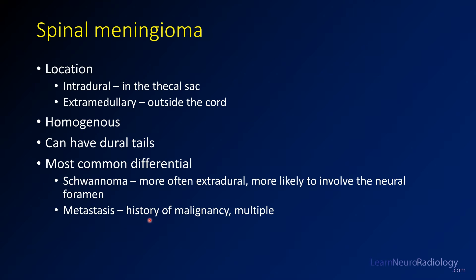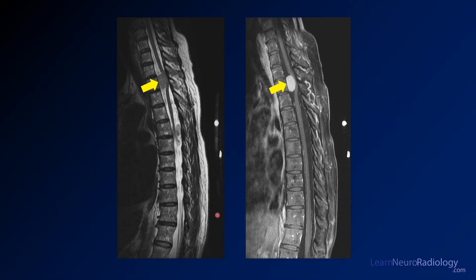For metastasis, you need to know from the history — usually those patients will have a history of malignancy, and often you'll see multiple metastases. In this case, there's a mass anterior to the spinal cord at around the level of T4 or T5. You see the spinal cord deviated posteriorly behind it, confirming it's outside of the spinal cord. It enhances very avidly on post-contrast imaging.